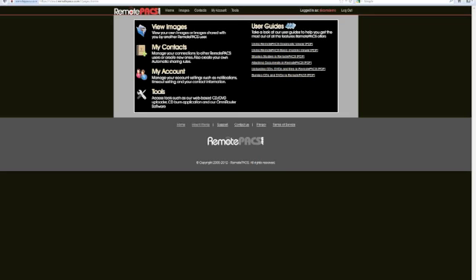Let's see here. Do we have any other questions? One of the things, too, is that RemotePACS is really well suited for mobile imaging because the routing software can be installed on numerous computers in numerous places. You have fewer options in terms of getting that speed bumped up for mobile imaging, because generally you're doing it from like a wireless card or something like that. But it is well suited.